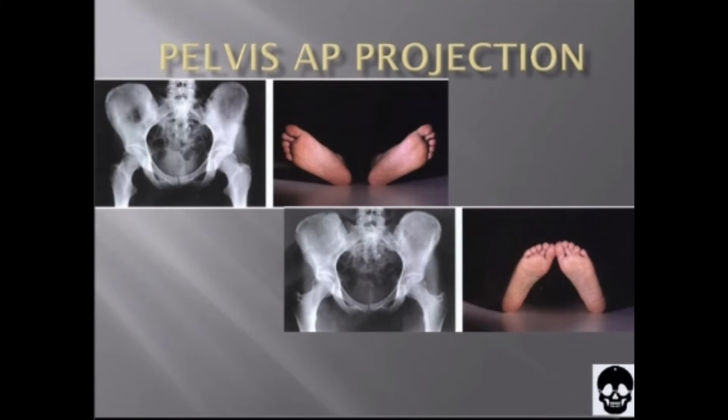The radiographer should palpate the highest point of the iliac crest. The highest point of the greater trochanter, which can be palpated immediately below the depression in the soft tissue of the lateral surface of the hip, is in the same horizontal plane as the midpoint of the hip joint and the coccyx. The most prominent point of the greater trochanter is in the same horizontal plane as the pubic symphysis.